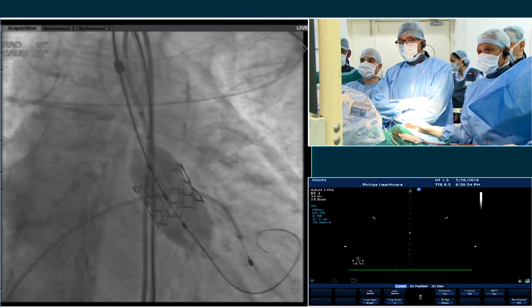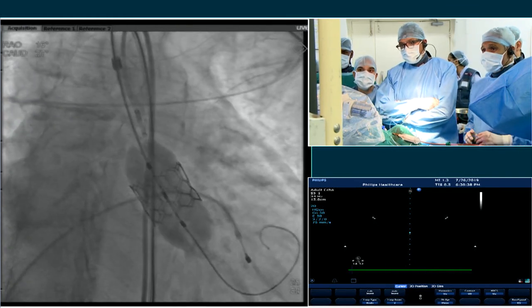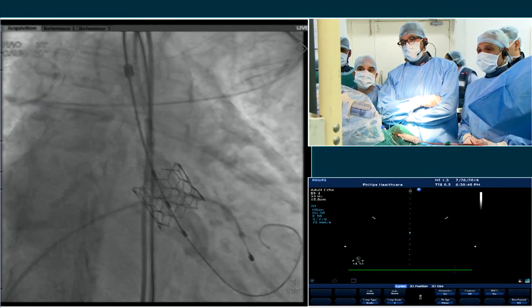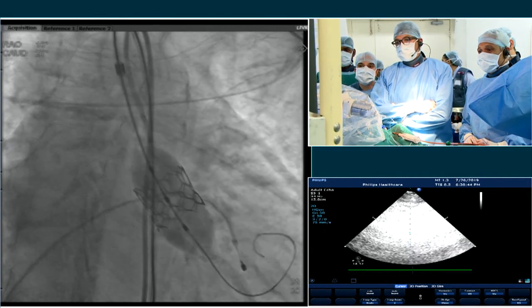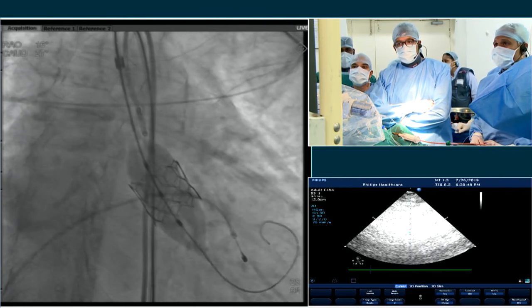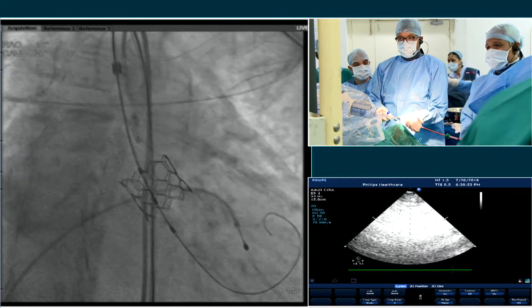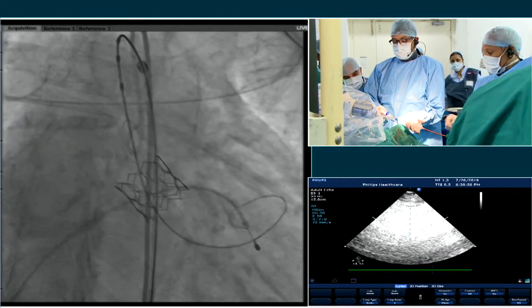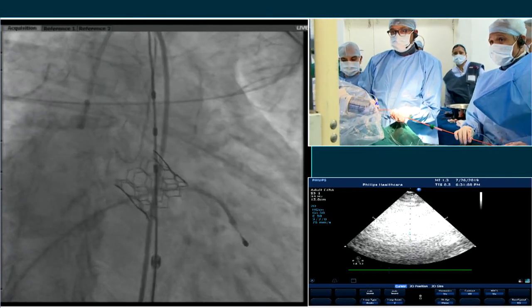With this inflator, it's hard to push, so I had to dial it in. But you do see expansion, but then it recoils right back, right? Yeah. So hopefully we have some improvement, but this tells me we're at the limit of what we're going to accomplish, because it's recoiling from the anatomy. So I'm going to come back out. I don't think there's a need to do anything more. It's on negative. So I'm deflating, taking the wire out.